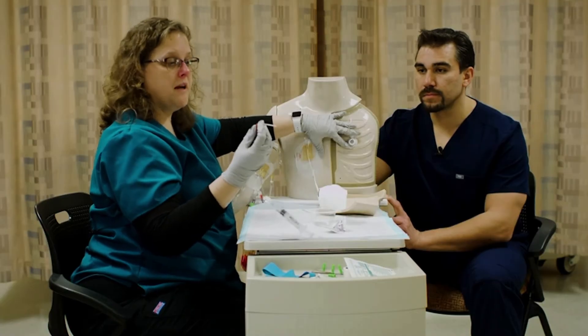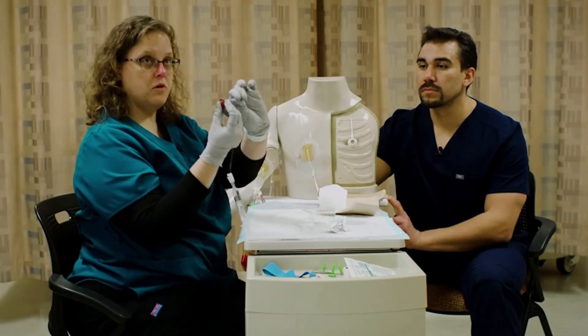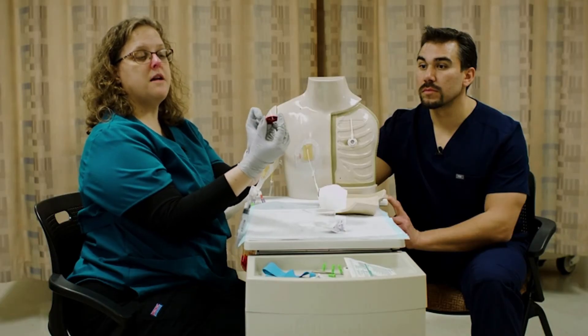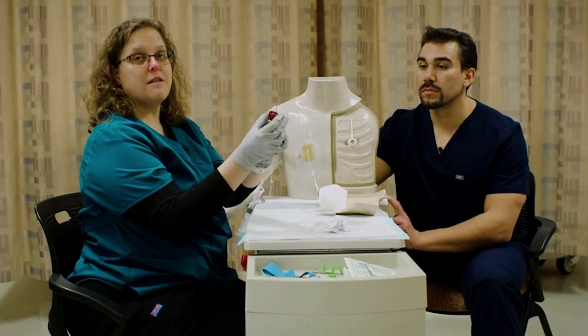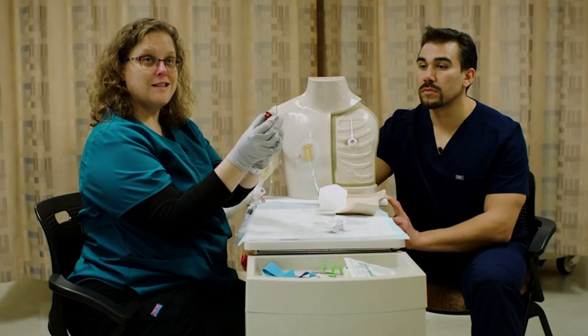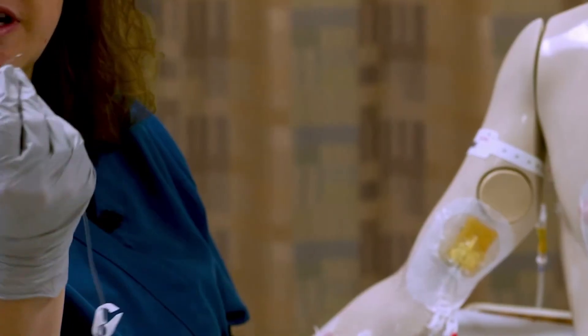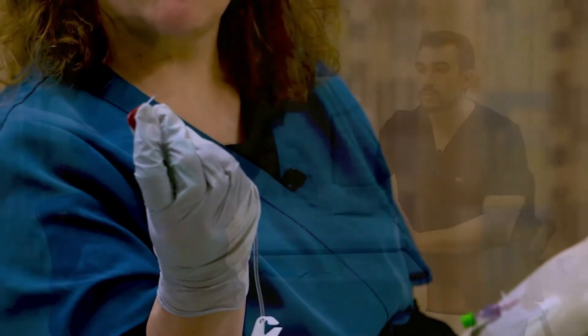Now I'm going to grab my needle and pull the sheath off. I'm not going to grab it here because that's actually going to activate the safety mechanism and cause me to not be able to use my needle. So I'm actually going to grip it pretty firmly to start with.